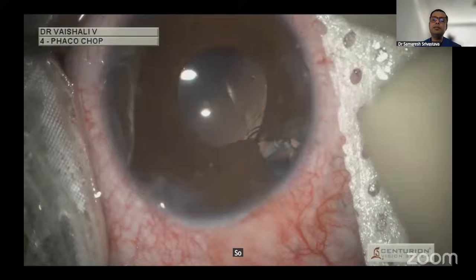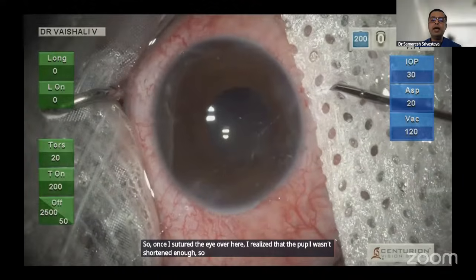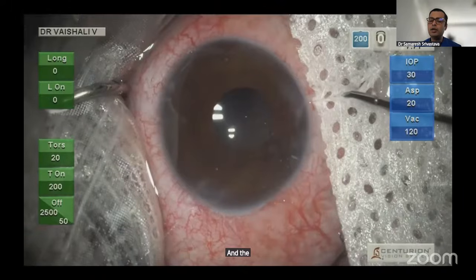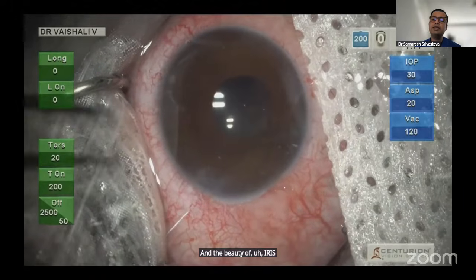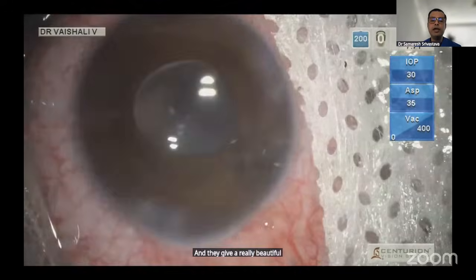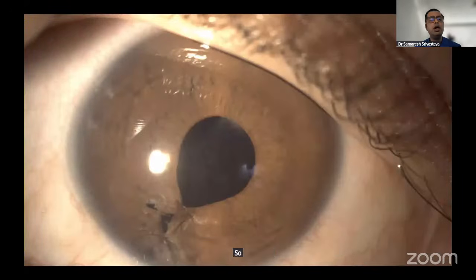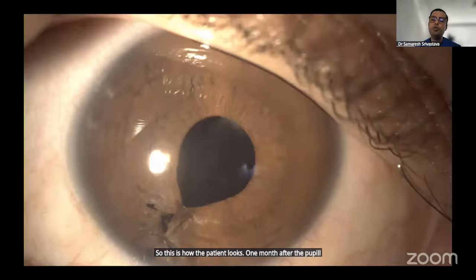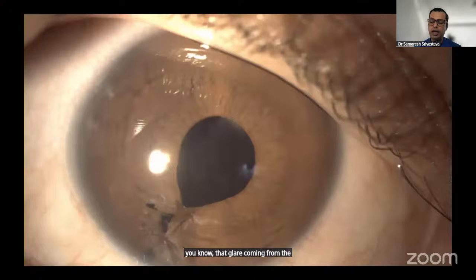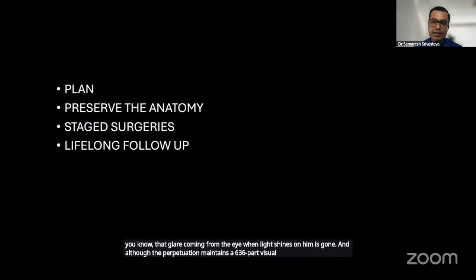So once I sutured the eye over here, I realized that the pupil wasn't shortened enough. So then I went ahead and did a second pass to make sure the pupil was made even smaller. And the beauty of iris repair is that the pupils are actually quite round at the end of surgery, and they give a really beautiful cosmetic outcome. And if the patient's retina is good, even a good functional outcome. So this is how the patient looks 1 month after the pupilloplasty, and a fairly round pupil. And the patient's complaint of glare coming from the eye when light shines on him is gone. And although the patient maintains a 6/36 visual acuity, the patient is generally happy.